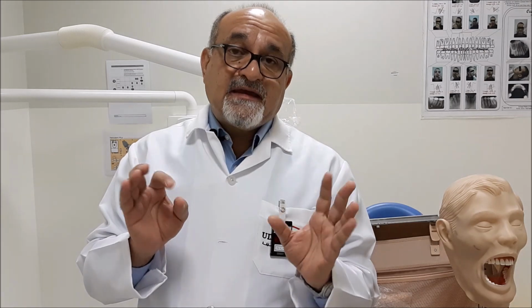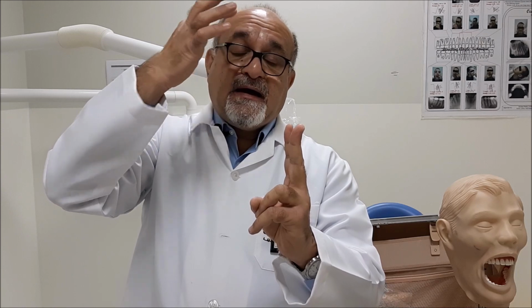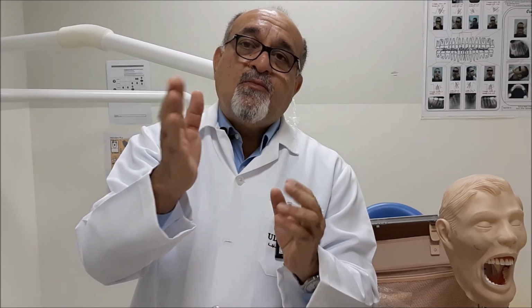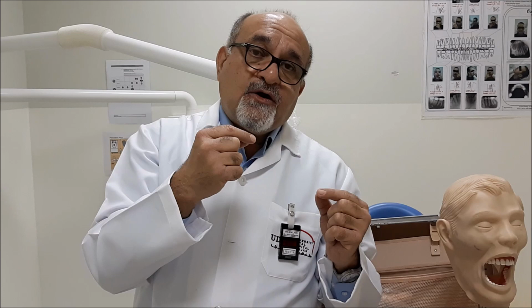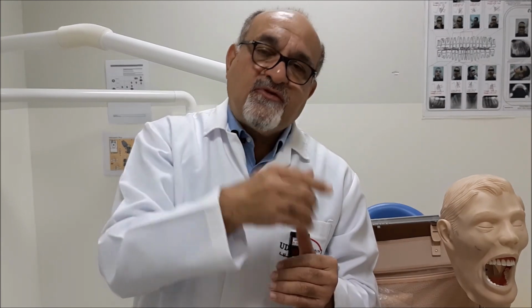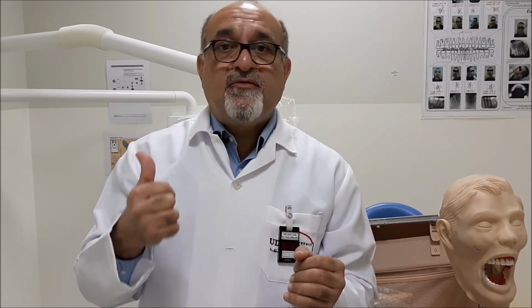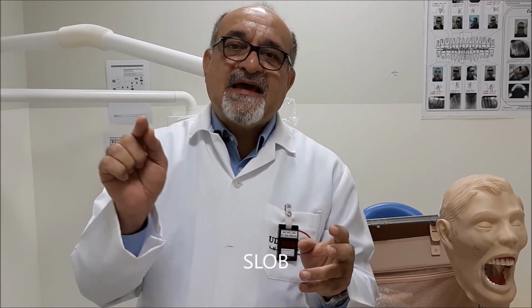In the tube shift technique, you move your source of radiation, the X-ray tube, so that the objects which move with your direction of movement are far from you, while the objects which move against your X-ray tube movement will be closer to you, which we abbreviate as SLOB.